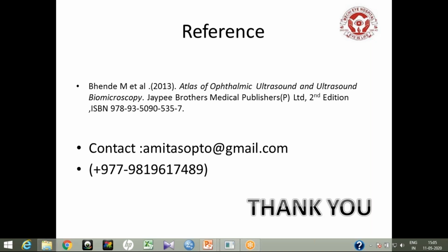Okay, thank you, Ajit bhai, that's great. So, sir, can we talk a little bit about the contraindications, like where we can't do the USG? We are very familiar with OGI and ocular trauma, but besides this, is there any contraindication for doing the USG?